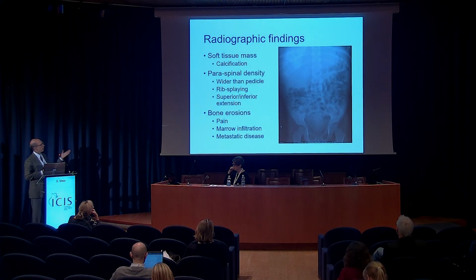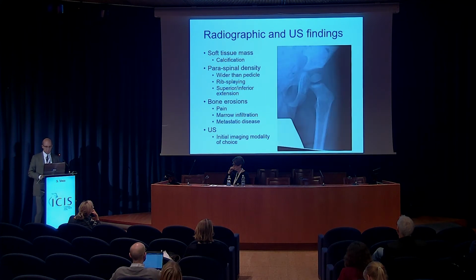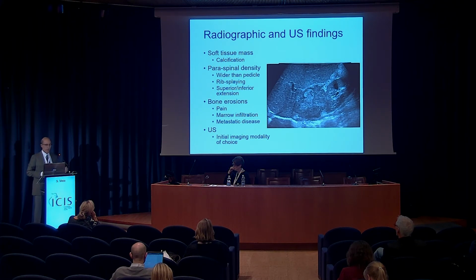child with neuroblastoma. Radiographic findings are common. This is something you've all seen. You see the right upper quadrant calcified mass with a very large corresponding calcified neuroblastoma filling the right upper quadrant. Another child who has periosteal reaction, you can see along the femur, and less obvious, but in the supraacetabular ilium, you see periosteal reaction. That prompted an ultrasound, which in turn revealed a right upper quadrant neuroblastoma. So those bone erosions, bone pain, marrow infiltration are all things that can suggest a neuroblastoma.